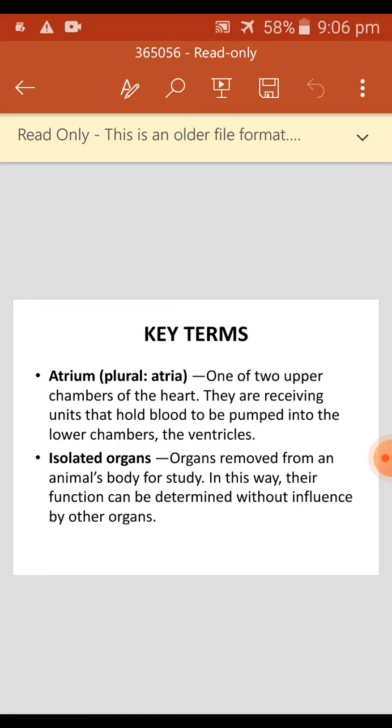Second one is the small roller pump. A pump with a shorter tubing path in the pump housing for lower flow rates, for example, for the perfusion of infants and children or for the administration of cardioplegic solutions, usually a double pump. Third one is centrifugal pumps for the arterial blood flow.